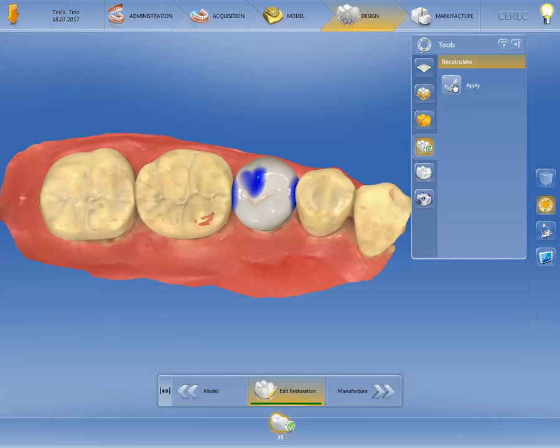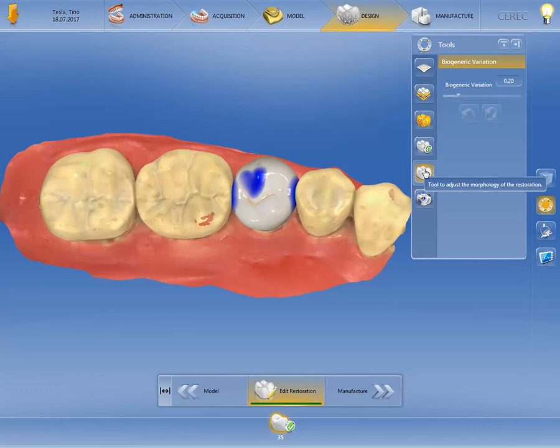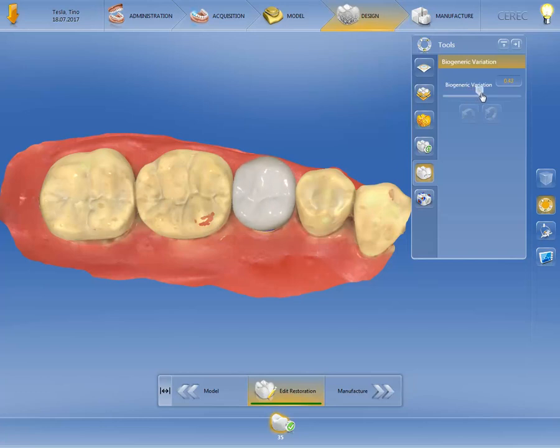We can also use the Biogeneric Variation tool. This allows us once again to modify the entire morphology for the restoration. Move the slider until the desired morphology is reached, then release the left mouse button and the CEREC software will adjust the restoration to the selected morphology.